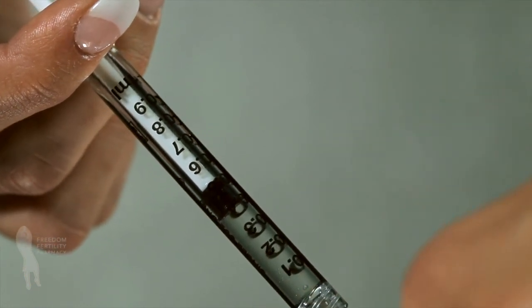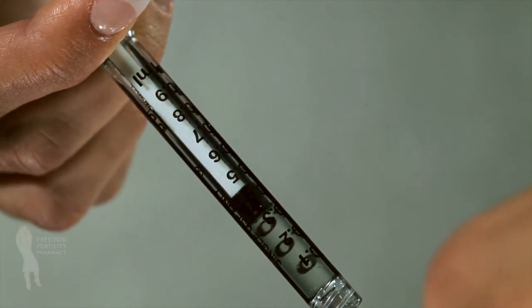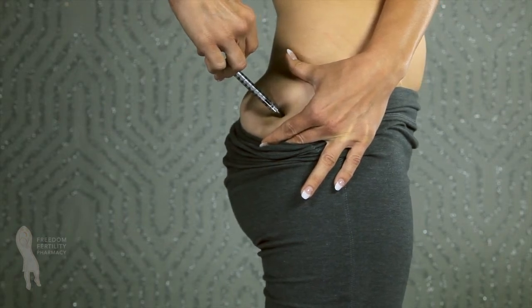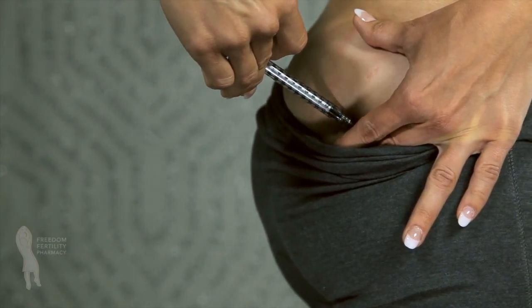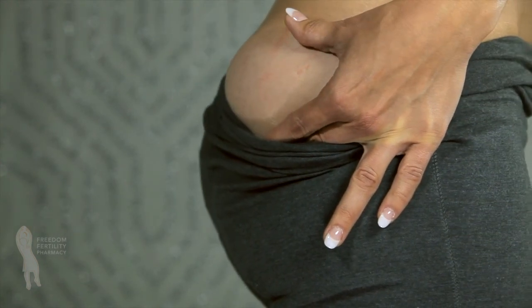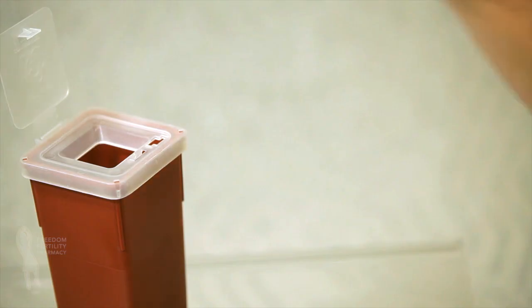If there is no blood, push the plunger in a slow, steady motion until all of the medication is injected. If there is blood in the syringe, remove the needle, change the needle, and start the injection again at a different injection site. This does not happen very often and is not a reason for concern. Once the injection is completed, gently withdraw the needle and apply pressure to the injection site with a sterile gauze pad. Once your injection is complete, dispose of the used needle and syringe in your safety container.